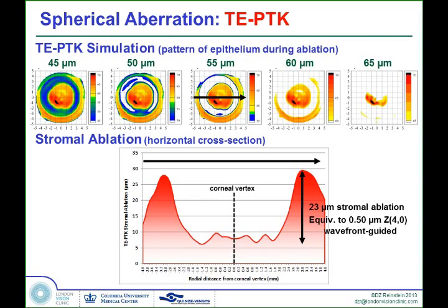Yeah, Tim is going to, in his section of the talks, show you what to do if you don't have this Artemis mapping to guide you. And also, intraoperatively, the epithelium and the stroma are very easy to tell apart. The epithelium still remains very shiny, and the stroma has a much more matte appearance. So you can start to gauge exactly where you are just by the appearance intraoperatively.